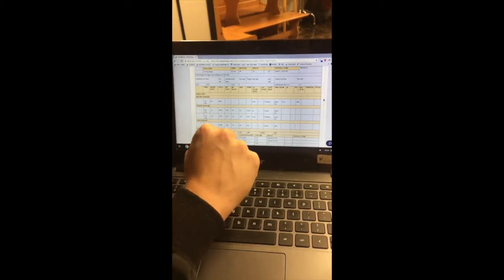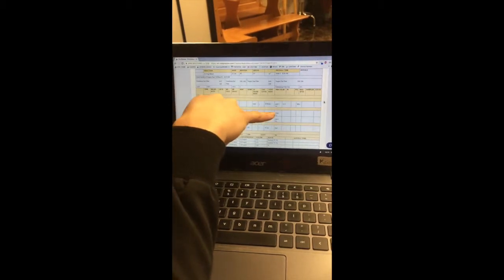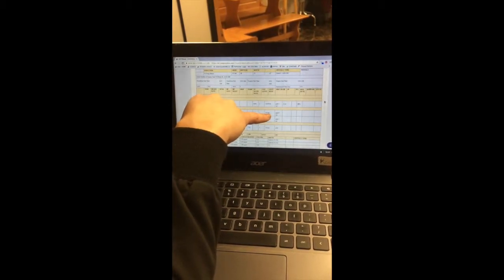So once we were in surgery, we have blood pressure readings for her: her systolic, her diastolic, and MAP. We have her temperature, her IV fluid rate. She was not hooked up to an IV fluid, so we have NA or none listed there. Her gas level, what her ventilation rate was. She was on 10 breaths per minute.